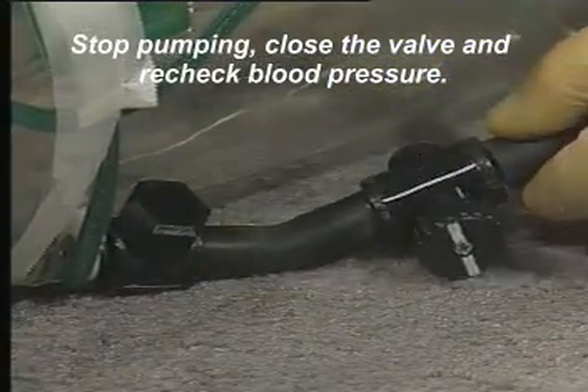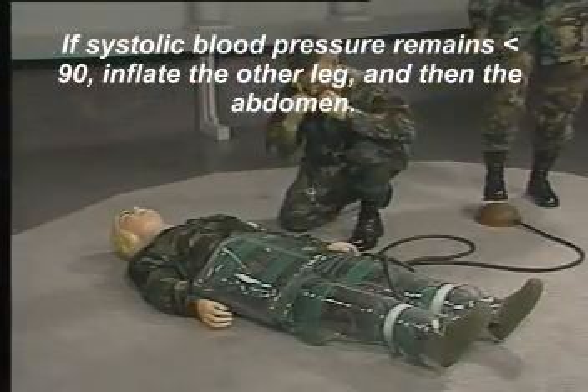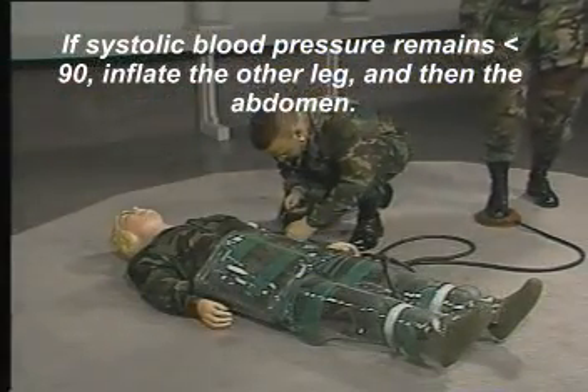Stop pumping, close the valve, and recheck blood pressure. If systolic blood pressure remains less than 90, inflate the other leg and then the abdomen.